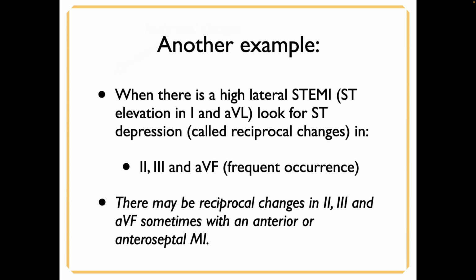Now the opposite is true for reciprocal changes. Not all well, I'll just start with this. When there is a high lateral STEMI, so Brandon, which leads are those, the high laterals? Is it 1 and aVL? Correct. So in 1 and aVL, look for ST depression in 2, 3, aVF. So it's just the opposite of what we just said, okay? Sometimes that's in italics because it's not common. You don't need to know that, but it's there if you want it.